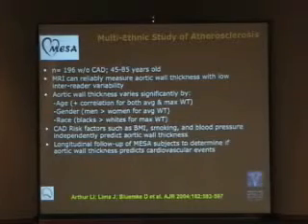So what are the findings? This is now in a setting that you want it to be: a multi-center setting, looking at subclinical disease, 196 patients, aged 45 to 85, showing that it's not only New York and Seattle that can do this, that MRI can reliably measure aortic wall thickness with very low inter-reader variability. There's a wall thickness correlation with age, and interestingly also with gender and race. That's one of the important aspects of that study. But also CAD risk factors such as BMI, smoking, and blood pressure independently predict aortic wall thickness.